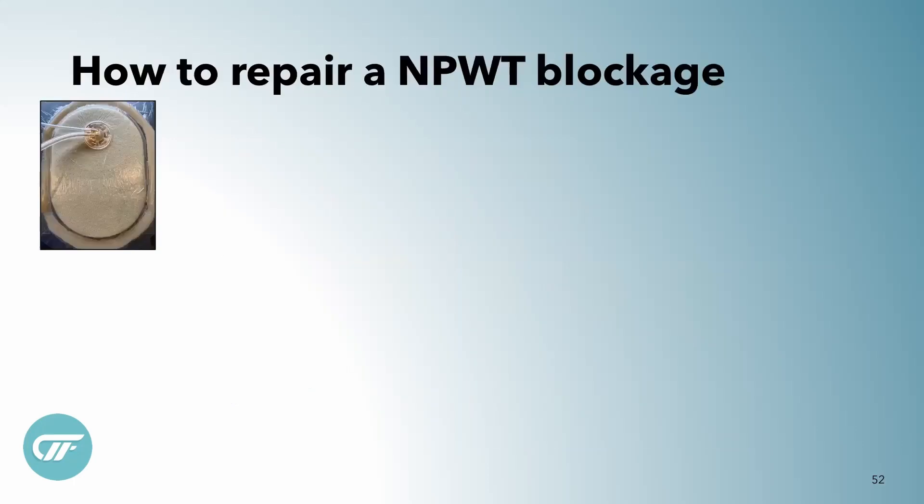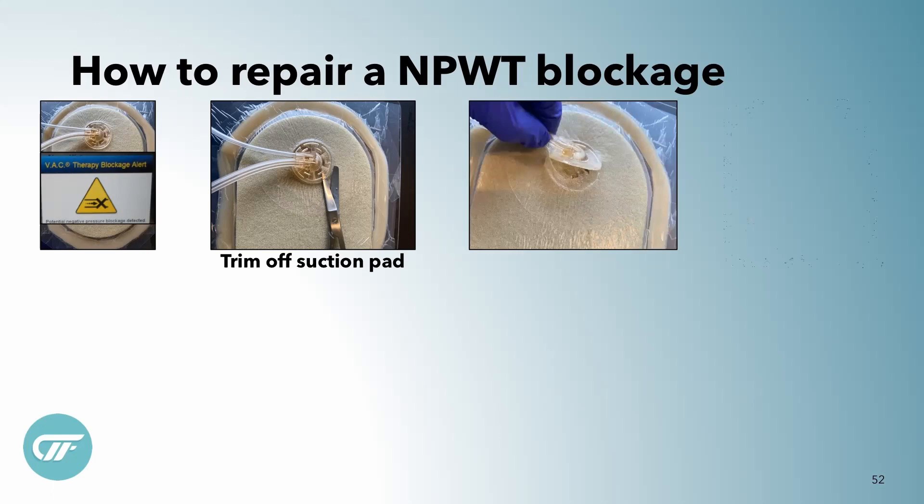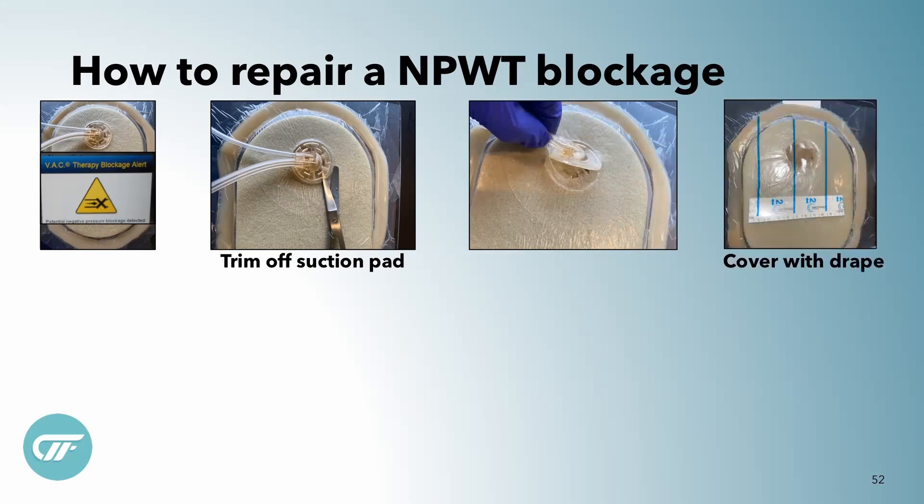So if I'm going to repair a blockage and I got the blockage alarm, it's not time to panic. You're just going to take that track pad and you're going to cut it free and peel it right off. I just do one little clip and then I just peel the whole thing off, and I cover that old hole with a drape.